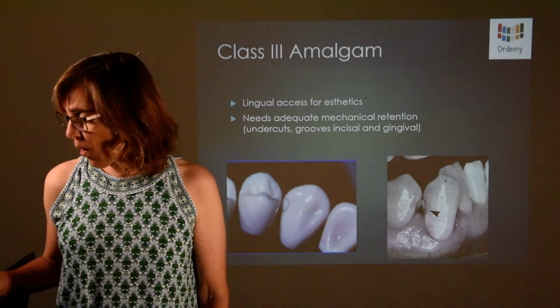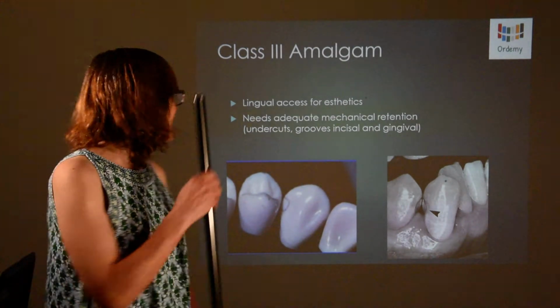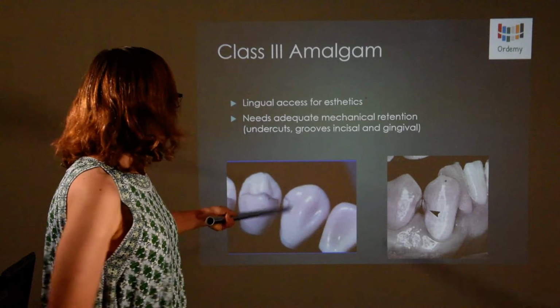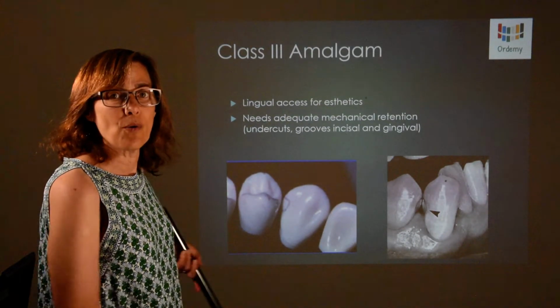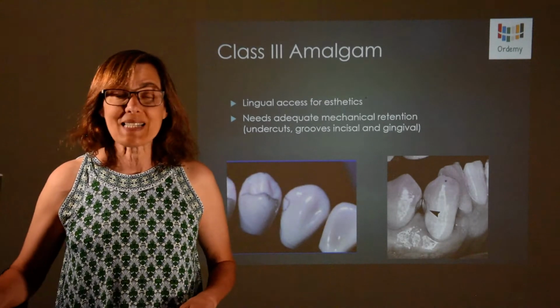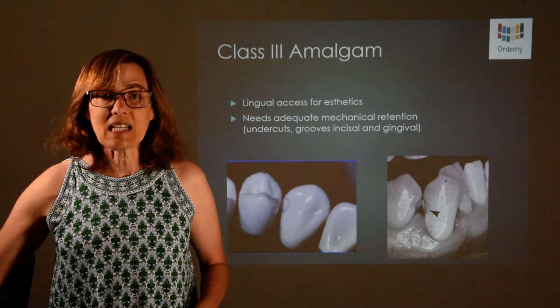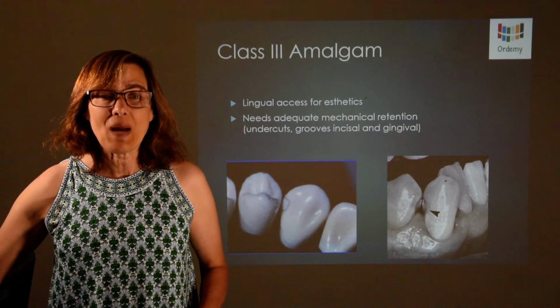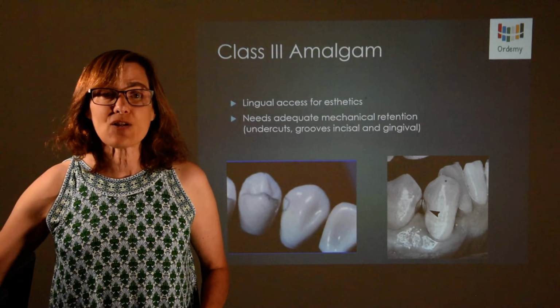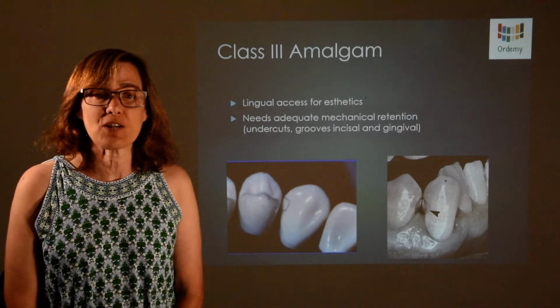They are located at the contact point or slightly below. They can extend buccally and lingually on the tooth surface. Therefore, access is a challenge for this restoration.